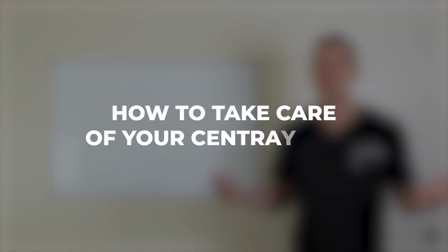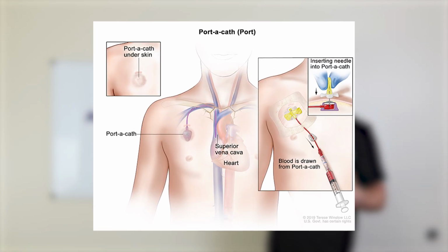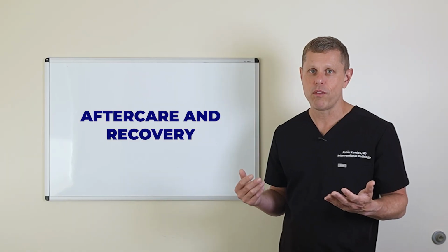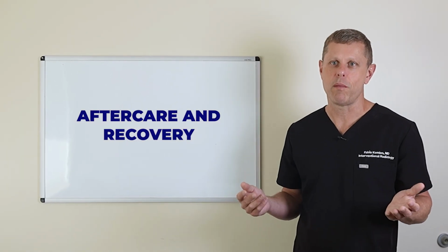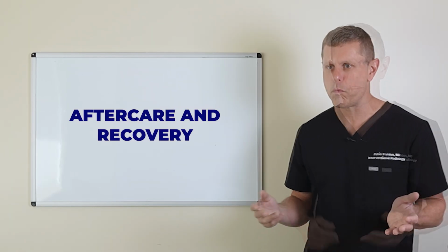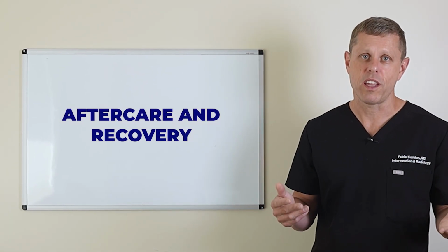Now, what do you have to do and how to take care of your central line? I'm going to start with the port because that's the easiest one, because the port's completely under the skin. So when the port is healed after a couple of weeks, you can do everything that you normally do. You can swim, you can shower, you can play golf, play tennis, do everything essentially, because it's completely under the skin and there's nothing sticking out.